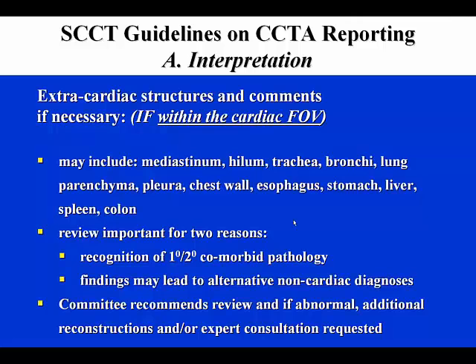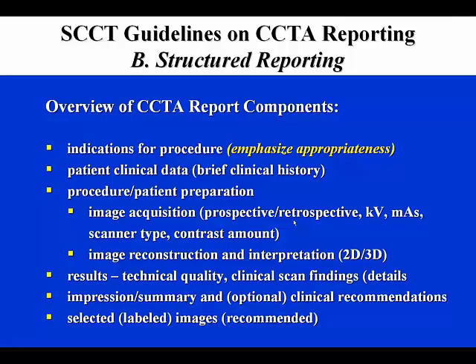The report should include indications for the procedure, emphasizing the appropriateness of the examination, a brief clinical summary of the patient's history, a review of the procedure and patient preparation, including image acquisition and image reconstruction, the results, including technical quality of the examination and clinical scan findings, including details, and an impression or summary and optional clinical recommendations. It is also recommended that selected labeled images of the findings be placed within the report.